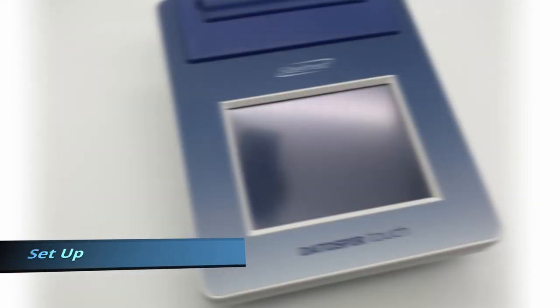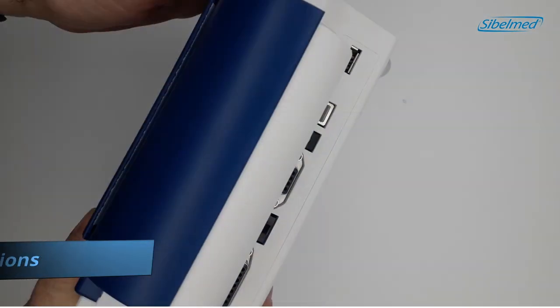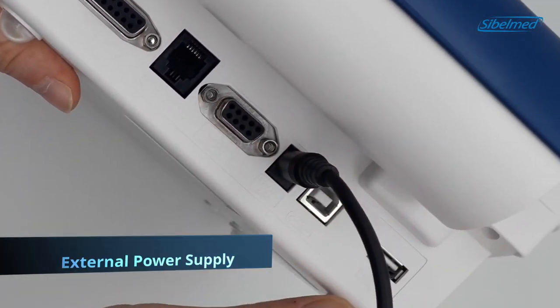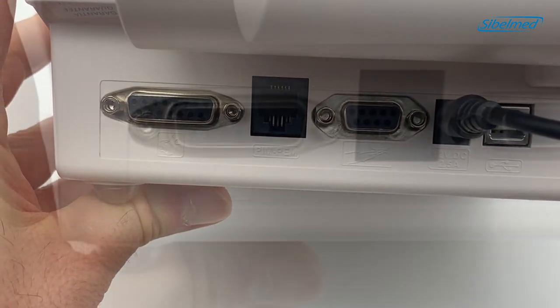Before turning on the device, we will plug all the accessories. First of all, we will connect the external power supply. Then, we will connect the transducer cable, located on the left side.